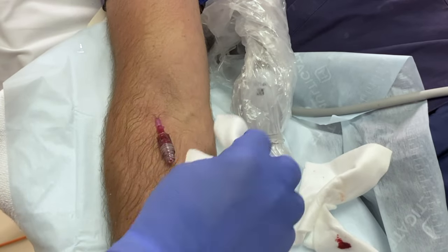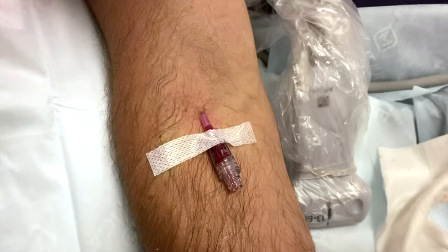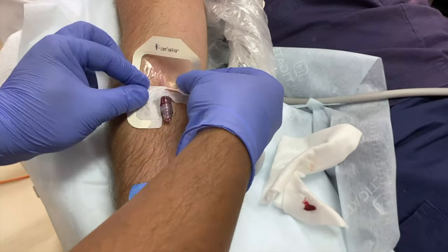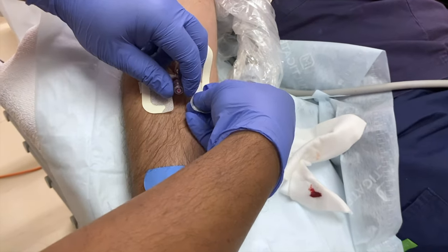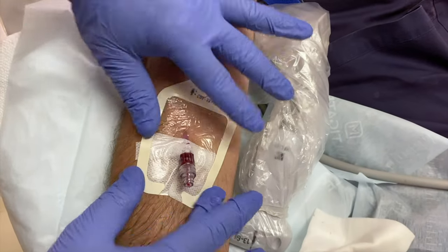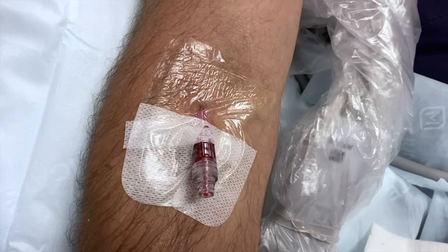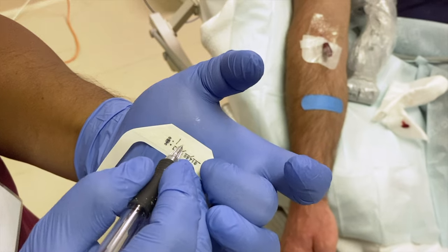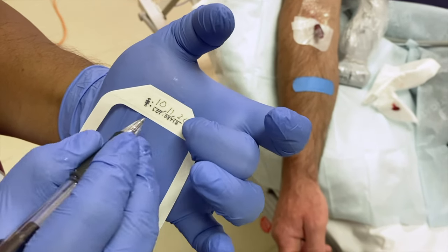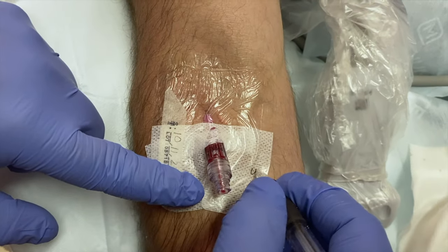Clean away all remaining gel carefully and apply dressings, ensuring the insertion site and colour of the cannula remain visible. Please do not forget to document the date, indicate ultrasound guidance and aseptic technique on the labels.